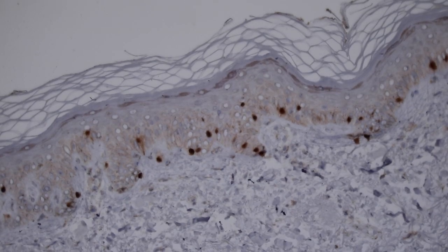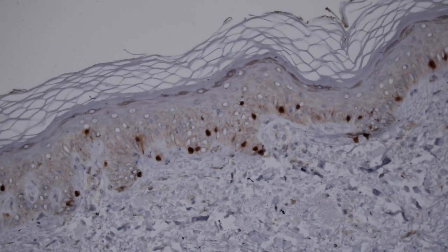And it will also stain other things too, like it stains Schwann cells and nerves. So it's not a perfectly specific marker, but it stains both benign and malignant melanocytes and it will also stain most nerves.